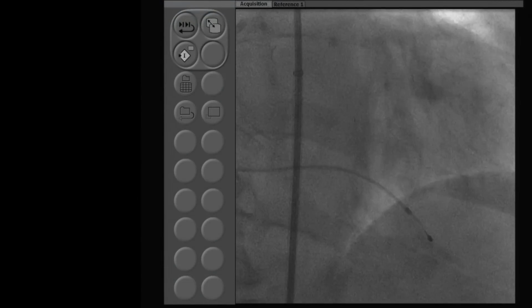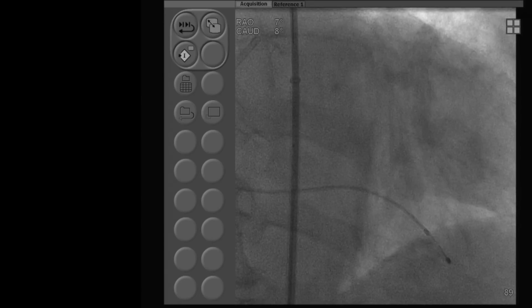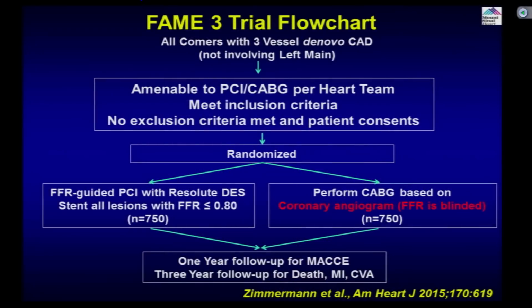Two pages, whatever, I mean, pictures. So let's quickly come back to our angiograph, the slide set, and then we'll go back to PowerPoint and see the presentation.